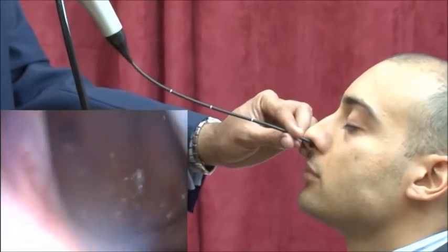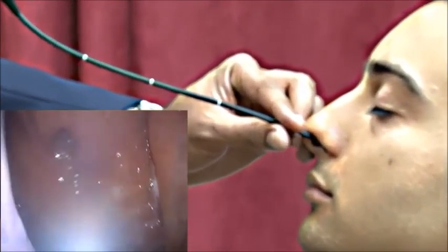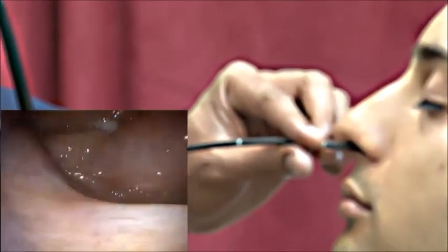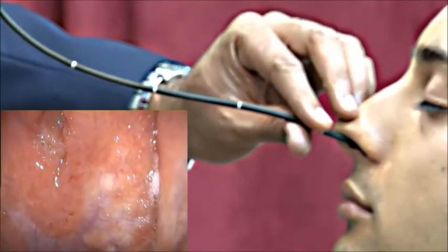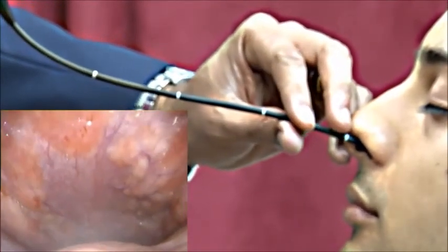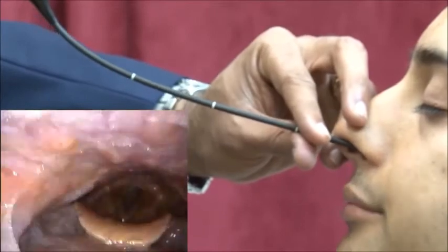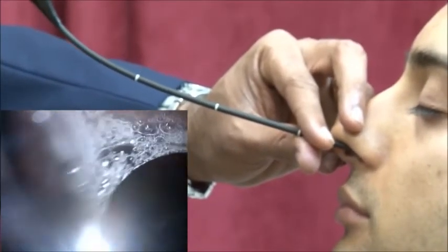That's the postnasal space over there, and you can clearly see that's where the adenoids would be, and that's the eustachian tube opening, just there. And behind that is the fossa of Rosenmüller. And now I'm going to go down, and you can usually get a very nice view, and that's a beautiful view of the tongue base and the epiglottis coming into view there very nicely.